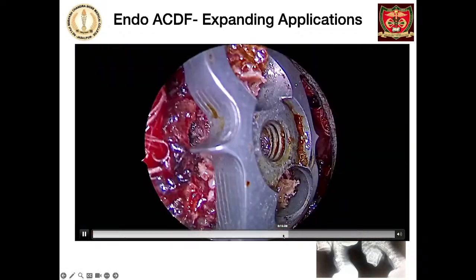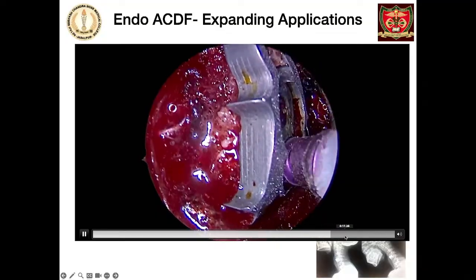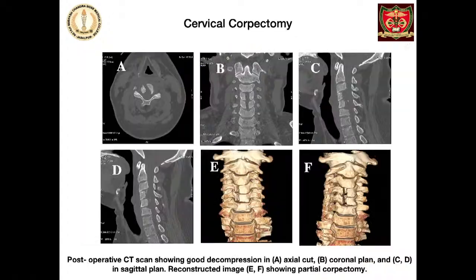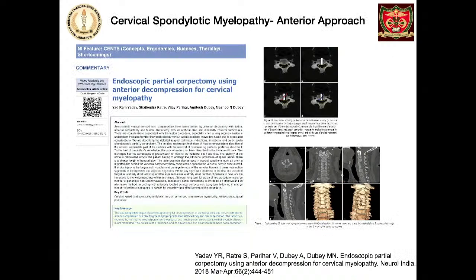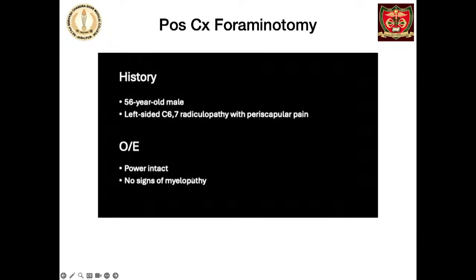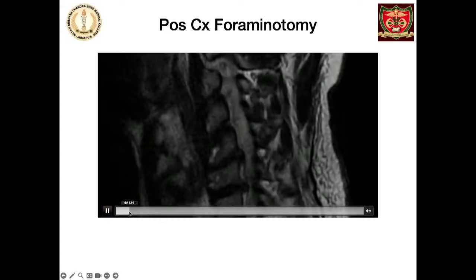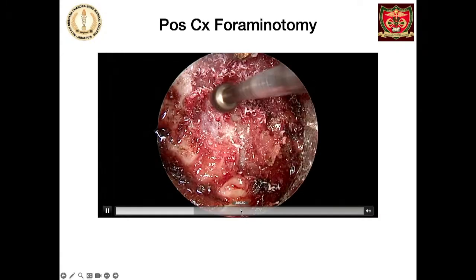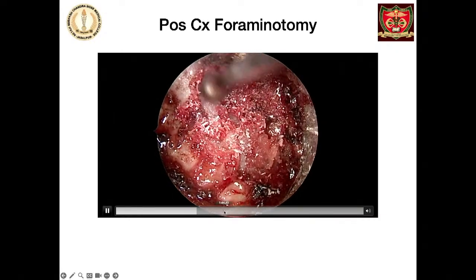And so we have published the disc preserving paper also. And if you want to do the fusion, if at all required, one can do a single level fusion with the same tube. So I just want to say that it is a versatile tube and does not require any specific additional equipment, and one can learn the principles which can later be utilized in biportal endoscopy. And these are the corpectomies, though I have not done them, but Professor Yadav, after gaining experience, has done these two level corpectomies, central and oblique corpectomy.